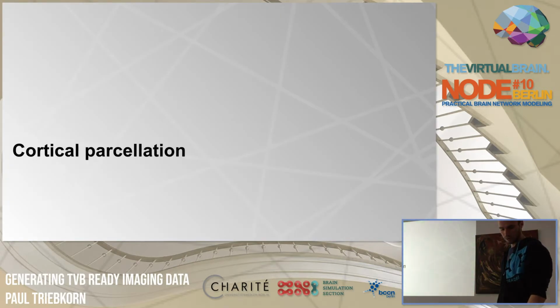Okay, now a few words about cortical parcellation. There are different brain atlases out there.